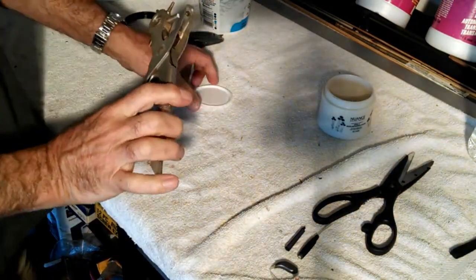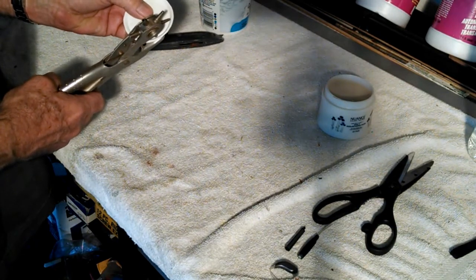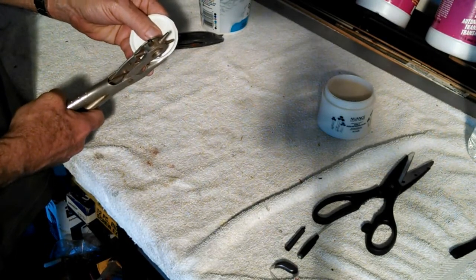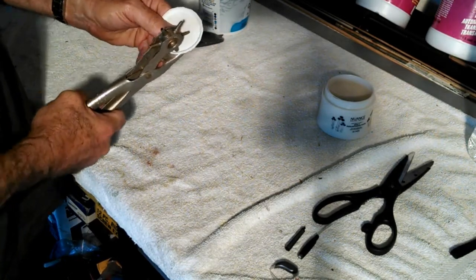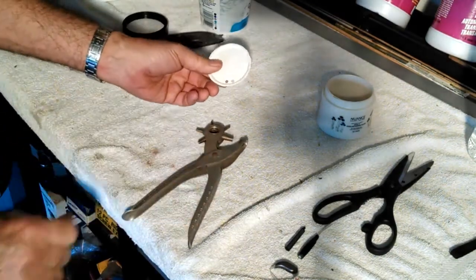This is a hole punch like you would use to do leather — you know, put an extra hole in your belt if you lost weight. I'm not going to bore you with the whole thing, but you'll get the idea. I'll show you when I'm finished.